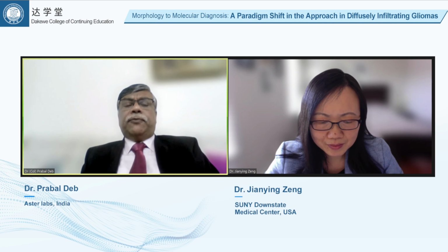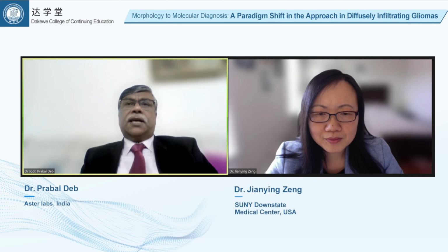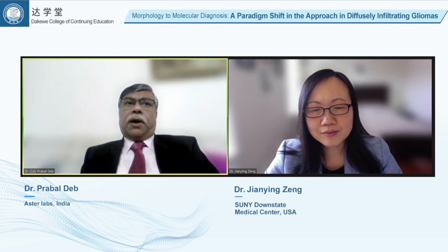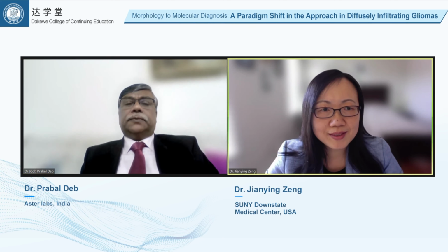Most of the groups that I know have had good correlation between the P53 antibody they use and the molecular result. There are very few cases where possibly there's a miss, and there would be a requirement to do a molecular TP53 mutation analysis, but I have never faced much of a problem in this. I see.